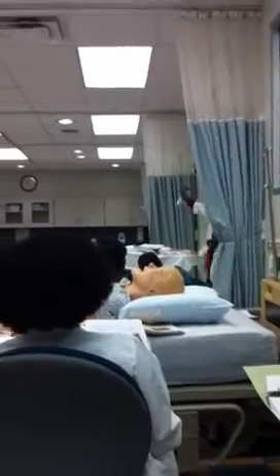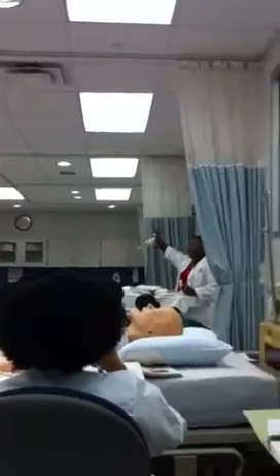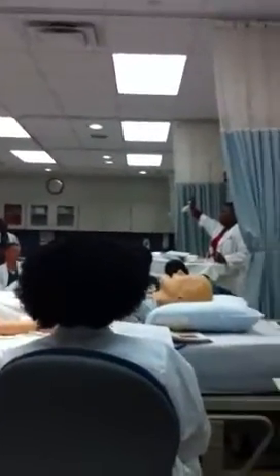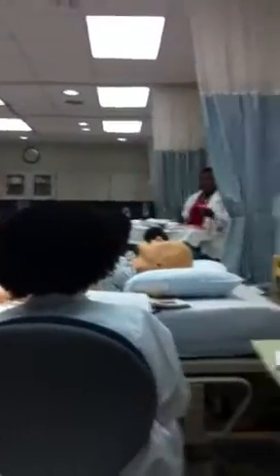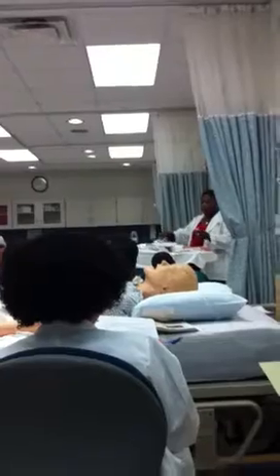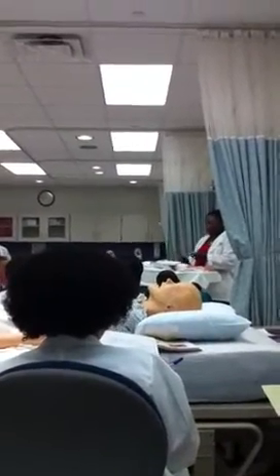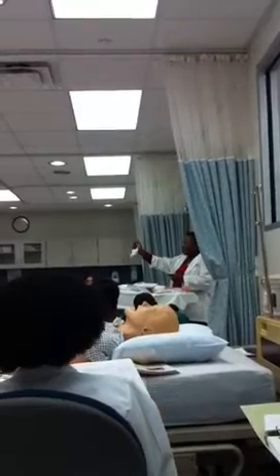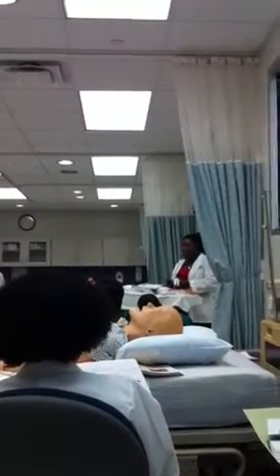Guys, don't ever let me see you give an injection without gloves. What if he bleeds? Alright, you always wear your gloves. So I have my supplies: my syringe, my insulin, alcohol swabs, my gloves. Those are the supplies that I need.